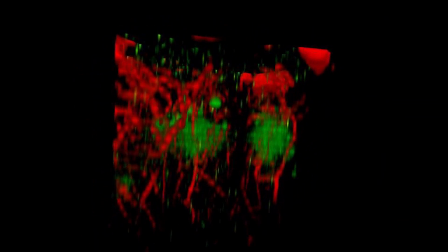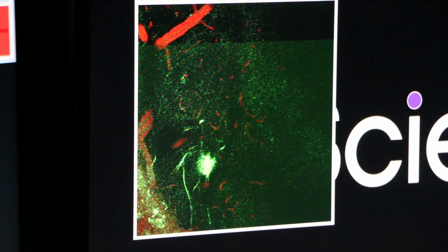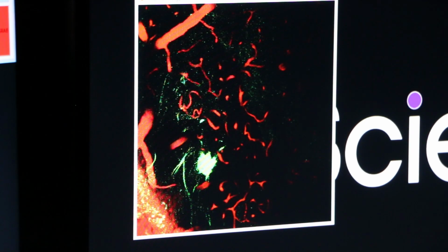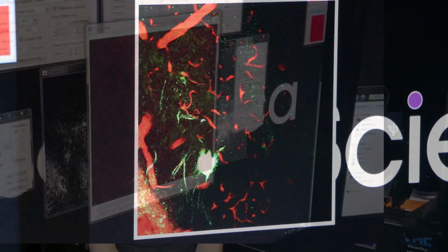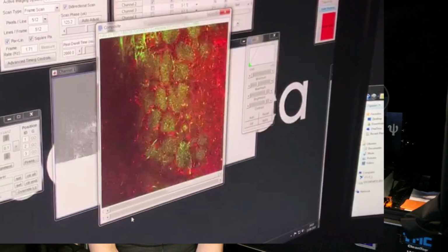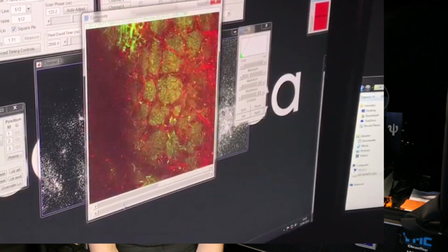So with in vivo imaging, usually the experimenter is limited by light that is being scattered along the way down in the tissue. And when we are trying to image from the projection neurons of the olfactory bulb, even though they are only down to, let's say, 300 microns, there's still a substantial amount of scattering on the way down, especially when it comes to fluorescent dendrites. And in our case, going down to 400 or 500 micrometers to reach the mitral cell layer and do calcium imaging from these cells, three-photon imaging can be very beneficial.